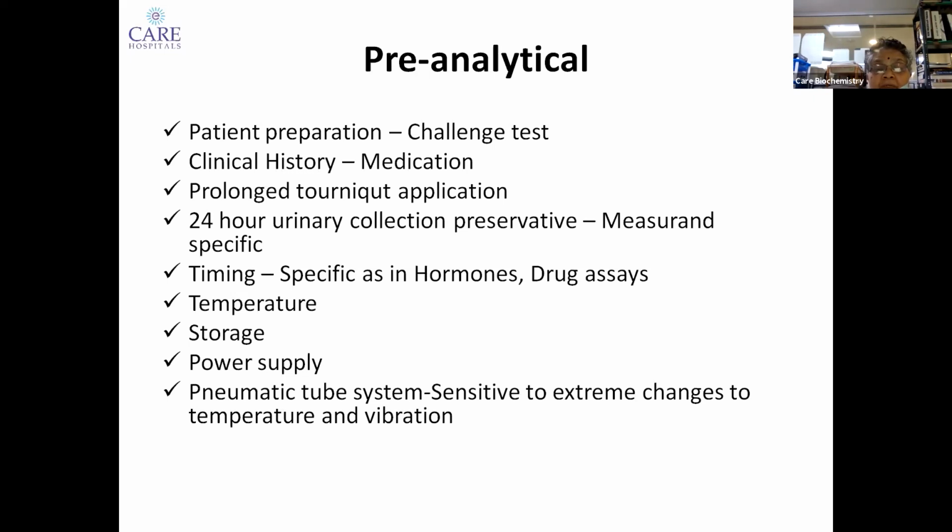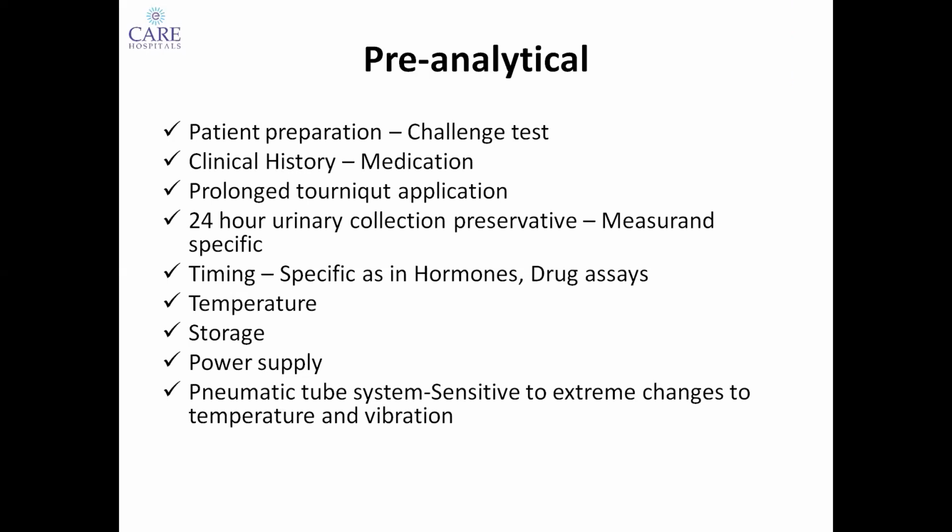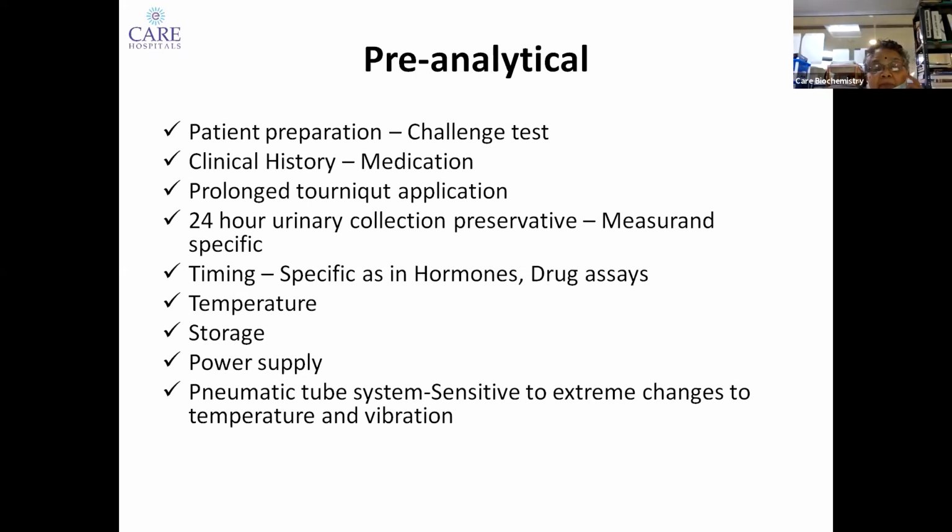The doctor is apprehensive what to do. Should he correct it? Then we have to say, no, send us a repeat sample. It's okay in a hospital lab, but how does it work in a smaller lab? How does it work in a standalone lab? How does it work if one does not have understanding of a tourniquet application? Yet another problem, a challenge, we have not yet reached instruments. We have not yet reached the lab source. We are still in the preliminary collection of samples.